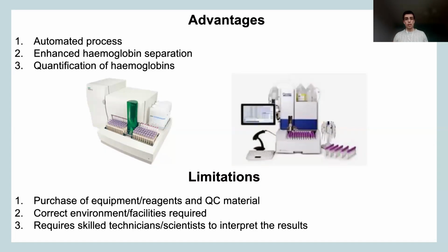It means that you will be able to detect some hemoglobin variants that might be ever so coeluting with A. So it is useful at various times. It also provides a measurement of hemoglobin A2 when there is presence, for instance, of hemoglobin E. In the BioRad analyzer it doesn't, because hemoglobin E runs exactly in the same position as hemoglobin A2, so therefore it's not going to give you an A2 measurement.